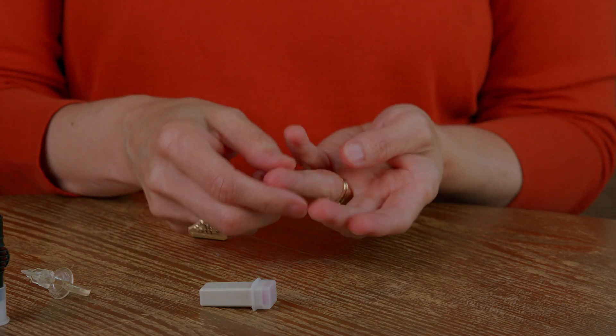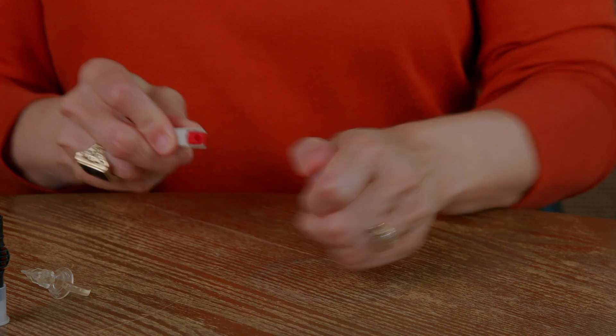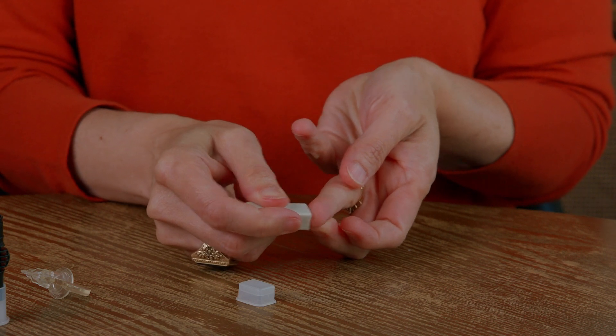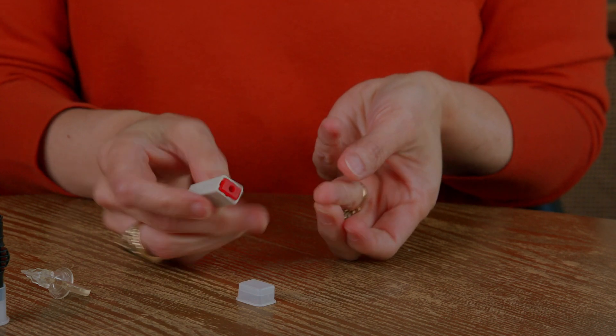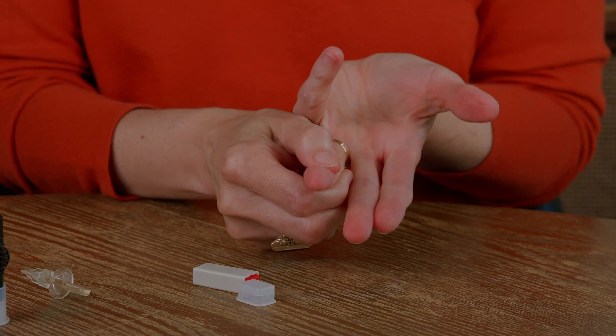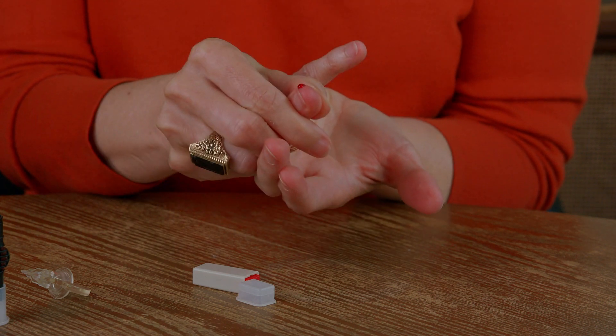It's important to note that the blood sample you collect for this A1C test is a little more than what you typically collect to test your blood sugar. I recommend pricking the soft area on the side of your ring finger. Place the lancet device like this and push down, releasing the needle to prick your finger. Gently apply a steady pressure to your finger to obtain an adequate blood supply. The size of the blood drop should look like this.